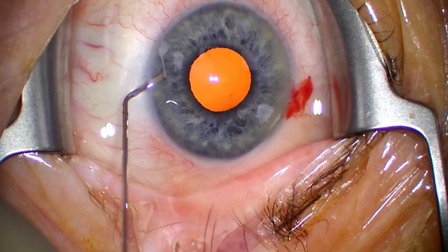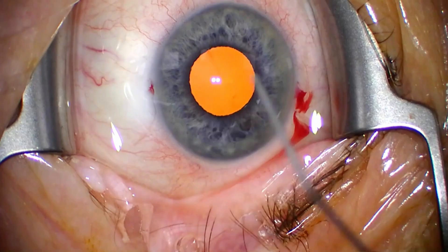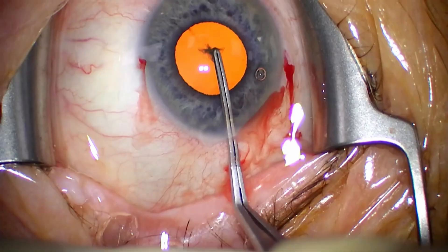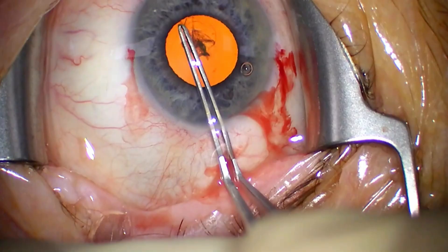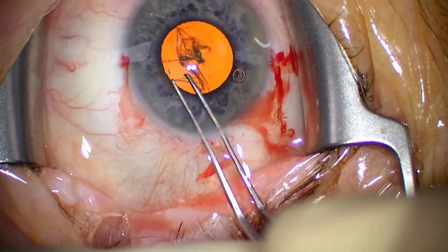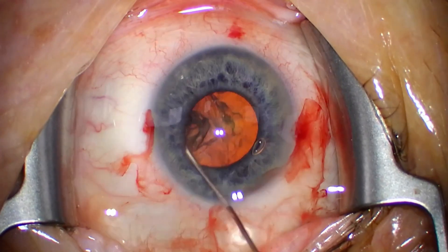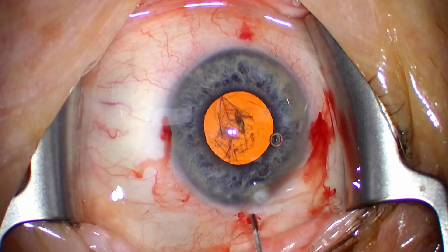You can see the pupil starts dilating, but even after reinjecting from the other side, that's as big as we get. We're filling the AC with dispersive viscoelastic and creating the incision. These cases are pretty easy for the rexis — you have a nice stencil here. We're done with the rexis.